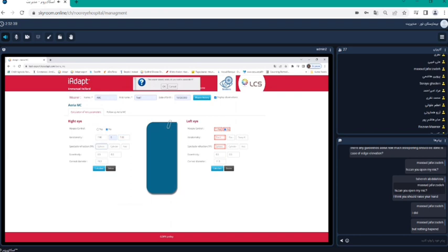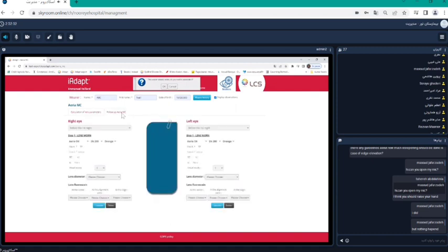Okay, if you have a -4, I go quick on that just to show you. It calculates automatically the lens that you can order. I go quick on that because it's just to show you what type of advice you can have online.